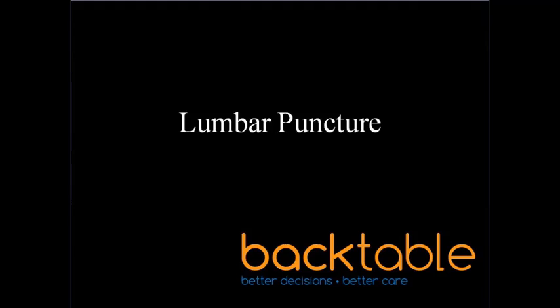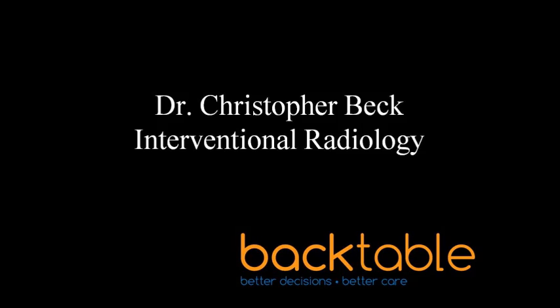Our topic today is lumbar punctures. I thought we would tackle this one in video format. There are lots of different ways to do this very straightforward procedure. I will show you my technique, but there are plenty of ways to get this procedure done.